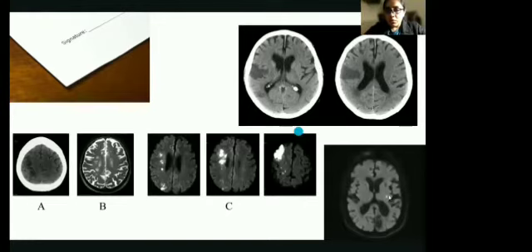Now, in the right corner, what we are seeing is a small dot, pretty much a lacunar infarct, which you see in people with atherosclerosis, hypertension, or diabetes. So immediately, you can correlate it to any of the underlying vascular risk factors.